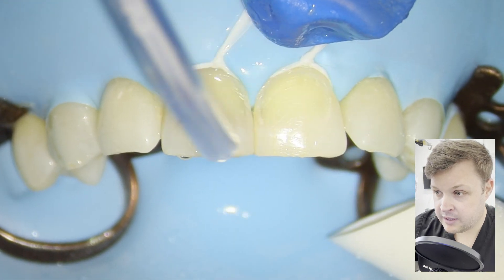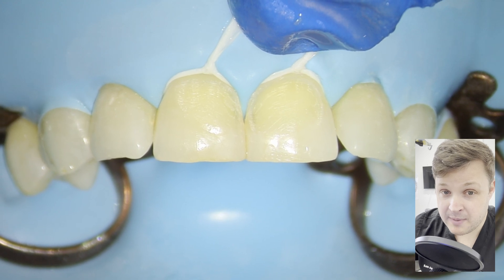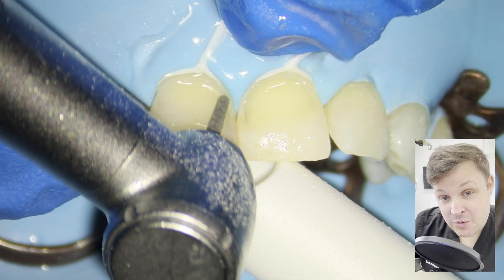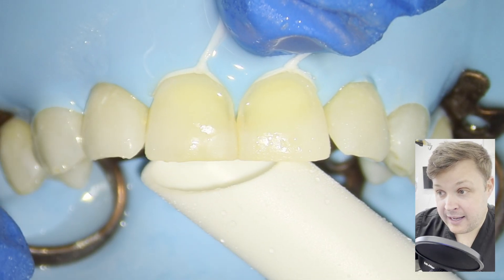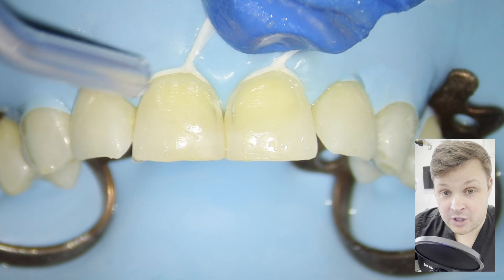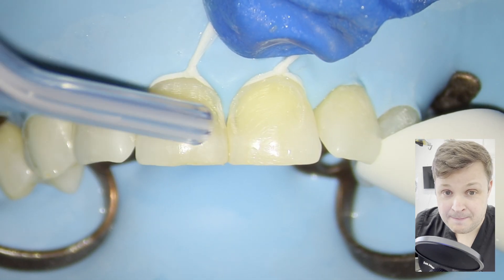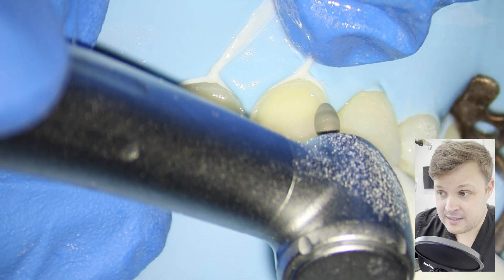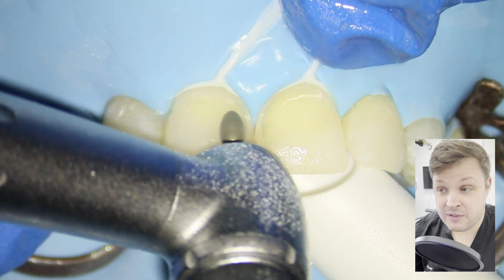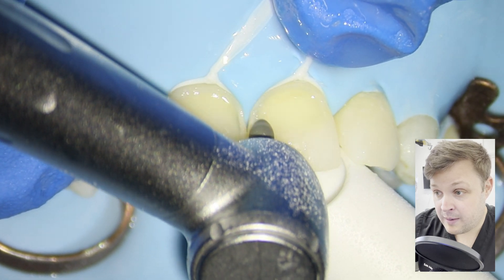It's a nice clear working field here. Some people like to do things without rubber dam — they might use an Optragate, which keeps your mouth nice and wide. I do use the Optragate every now and again, but I went on a rubber dam course about five years ago and doing fillings like this is just easier. You might feel it's a bit daunting at first and your first few cases you'll have sausage fingers, but if you do this all day every day, it's just easy.